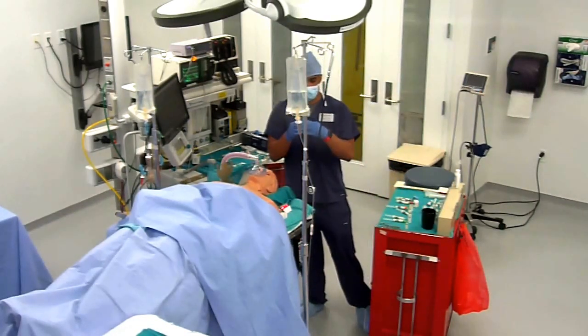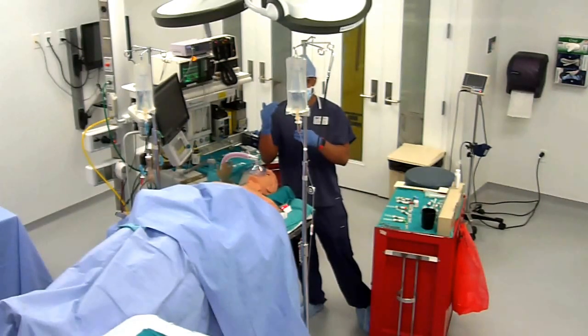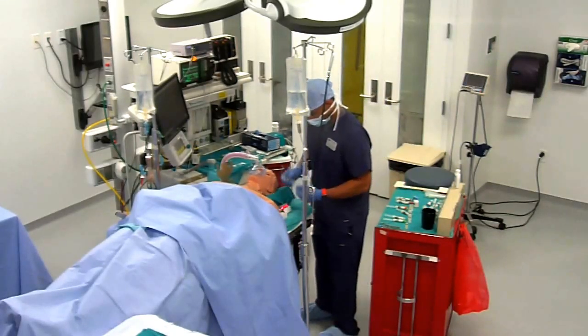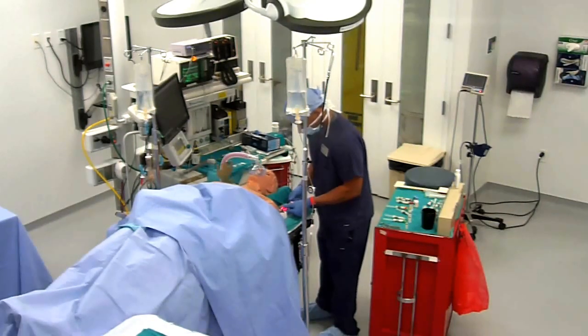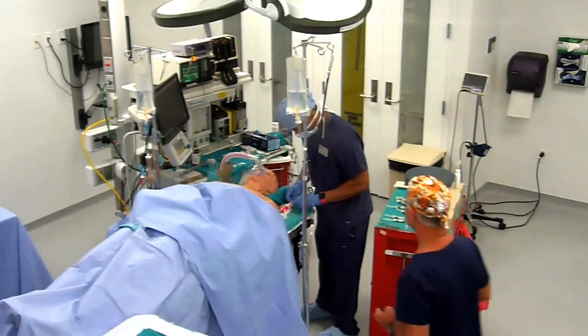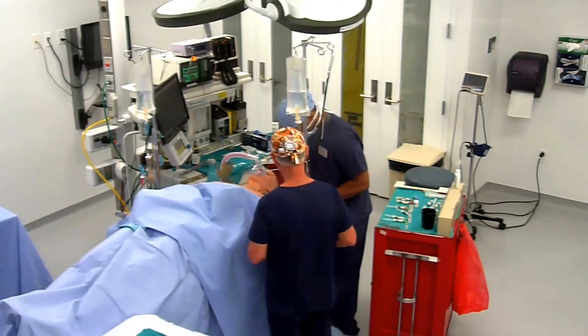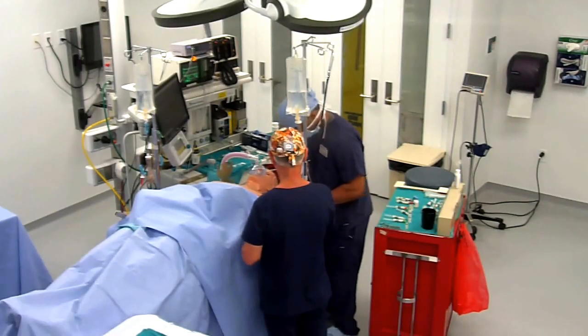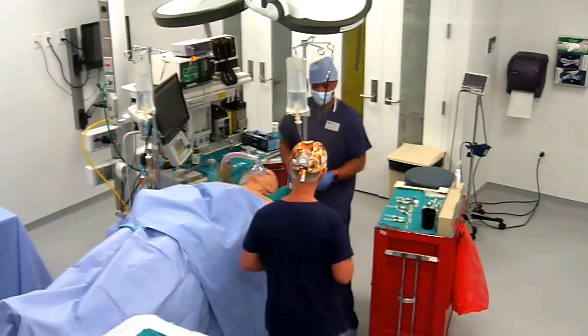So here's another 70 milligrams, 7 mils of propofol. And then stopcock towards the syringe, my finger out of the way. Green light says okay. It's kind of off and on. There it goes. That's kind of hard to push. Let's go ahead. Even though the green light's not on. Good.